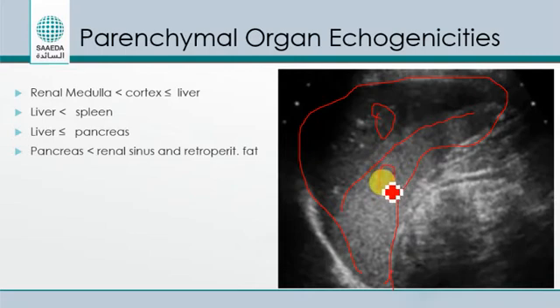And what's going on here? Does the spleen have two different echogenicities? Another thing to notice here is that this part has some vessels in it, more than this. This part has no vessels, okay? What happens here is that this is the left lobe of the liver, going all the way to the left side, hugging the spleen. And you can see both of them in one image.